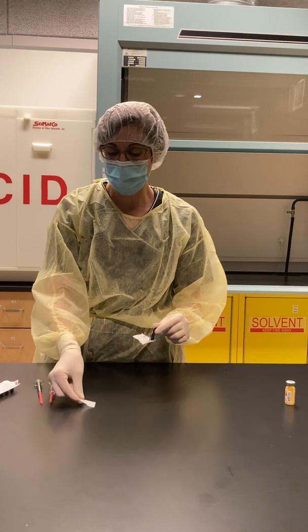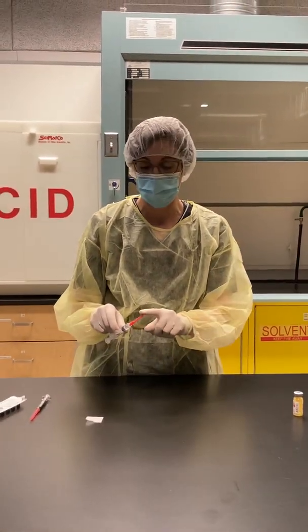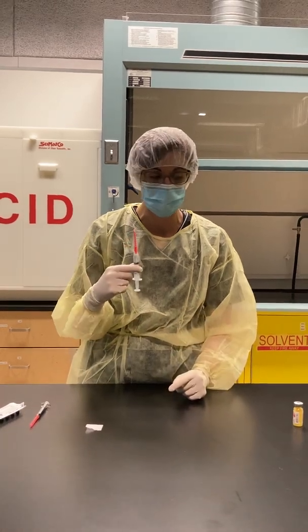We get another alcohol swab ready, and this is for the cap of my needle that contains my two mils of sodium chloride.